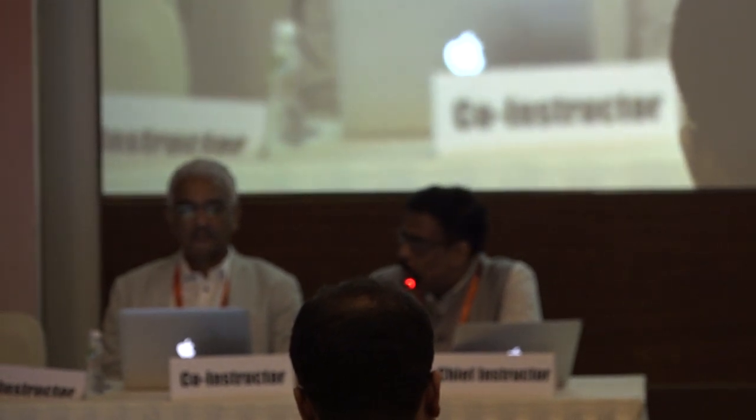Usually in all diabetic retinopathies, the cases are not simple. Sometimes you think in ultrasonography you can't detect this membranous proliferation, flat tear, disc. Now during the surgery you will see a lot of attachments, multiple focal adhesions. So any comments from Dr. Maiti? Dr. Boral, do you think this kind of case needs ILM peeling, because in Dr. Dharmesh's case also there was a little bit of puckering underneath the tractional retinal detachment, the fibrovascular proliferation?